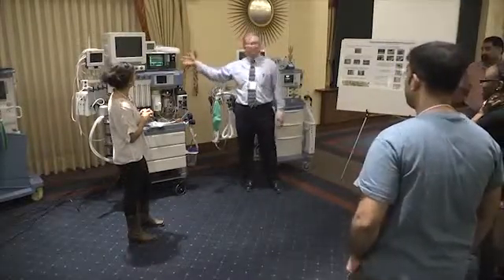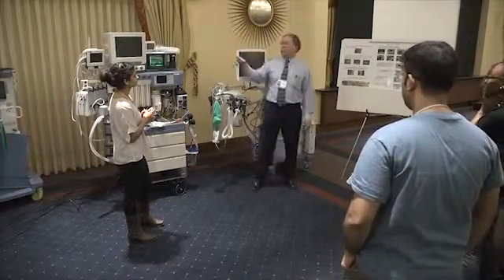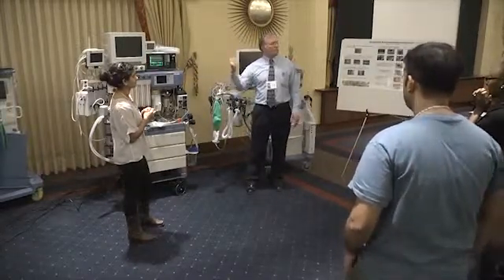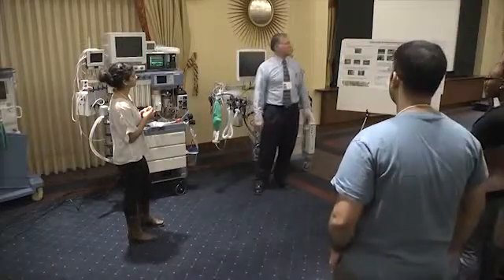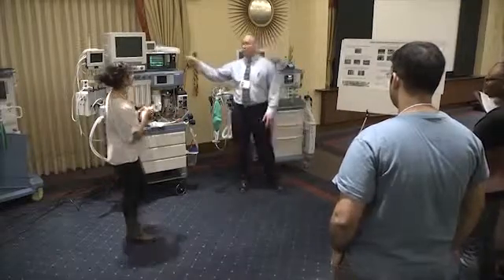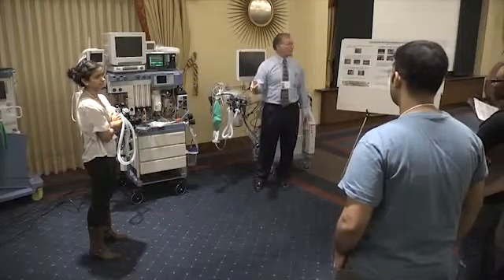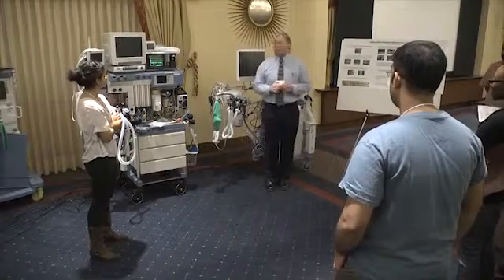I've repaired these things extensively over my career, and I can tell you a lot of times you turn these things on, and you wait for this, and you wait for this, and all of a sudden you realize, oh wait a minute, 5 minutes has gone by. Oh wait, 10 minutes has gone by. This thing isn't going to work, and then all of a sudden it goes out of calibration. And then you get that. Now you've been waiting 10 minutes, so you tell somebody to bring you another one of these, right? And if it's been in an area where it's cold, it needs another 5 minutes to warm up, and now the whole thing is delayed, all over something you could have prevented.